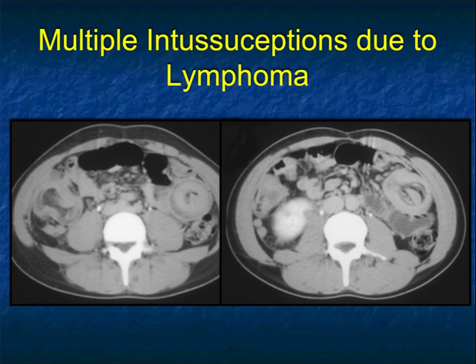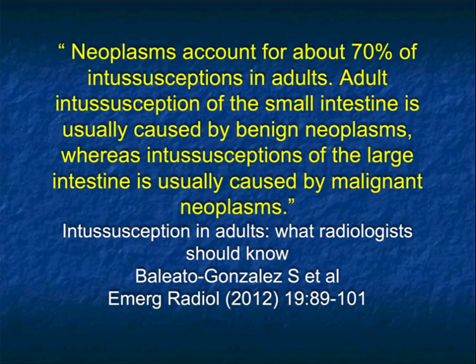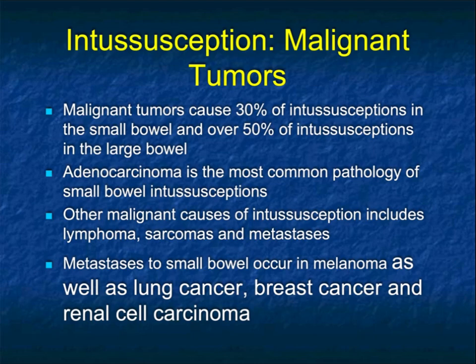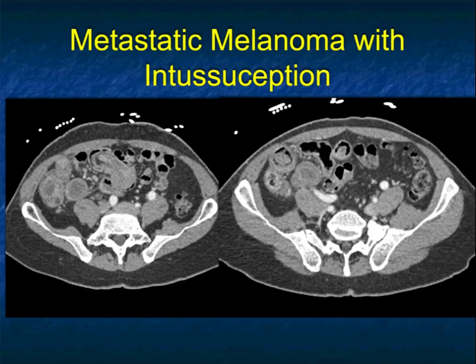Here are multiple intussusceptions in this patient, along with involvement of the patient's right kidney. Neoplasms account for about 70% of intussusceptions in adults. Adult intussusception of the small bowel is usually caused by benign lesions, whereas intussusceptions of the large bowel are usually malignant lesions. Adenocarcinoma is the most common pathology of small bowel intussusceptions, but lymphoma, sarcomas, and METs can all do the same thing, as can melanoma, lung cancer, and breast cancer.